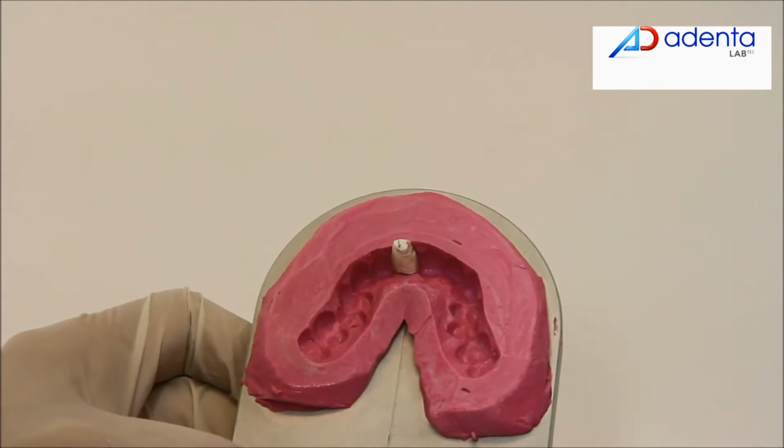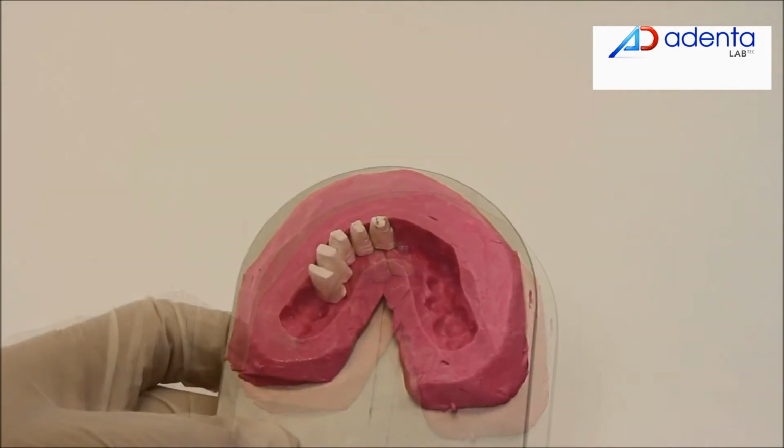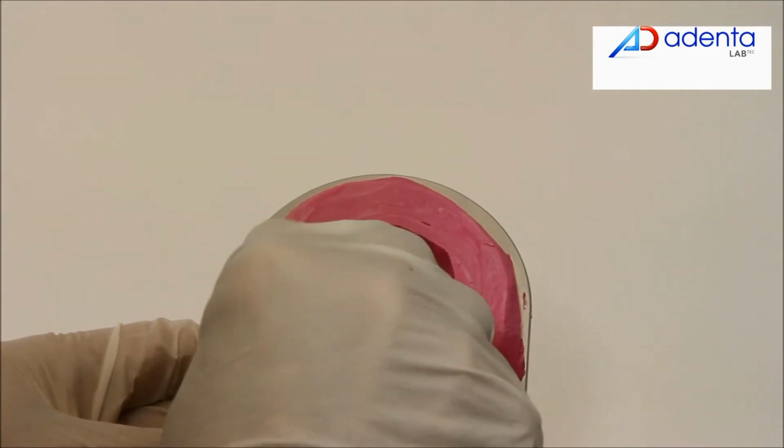Now put the trimmed teeth into the silicone impression. You can identify them easily following the identification numbers you had written on them before.